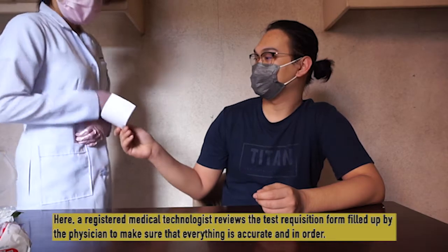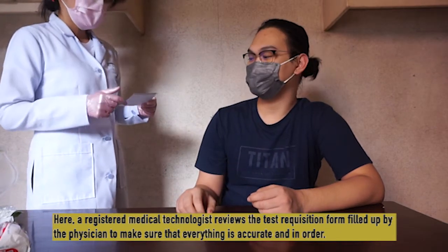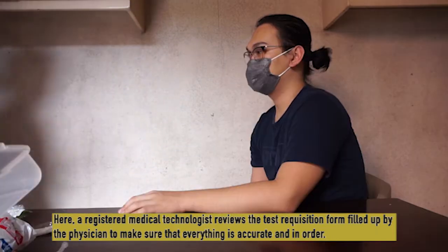Here, a registered medical technologist reviews the test requisition form filled up by the physician to make sure that everything is accurate and in order.